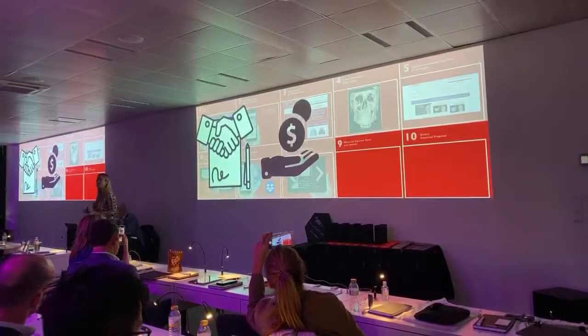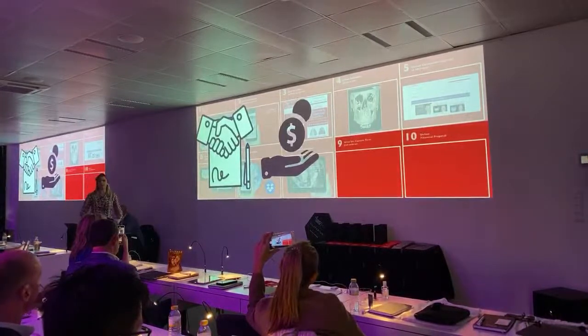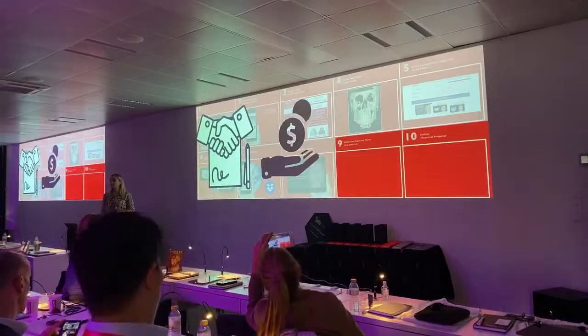Then we have the complementary phase, where we increase the vertical dimension with provisionals, but we stop in provisional. And then we have the restorative phase, that is when we change to ceramics. So the patient received the financial proposal of the first phase.